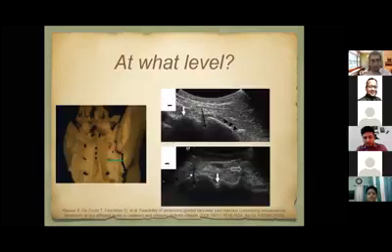So here I am trying to show the sacral foramina in this image. You can do it at the S1 foramina or at the S2 foramina. This is the first image at the S1 foramina. So this is the S1 foramen. When you move from the midline to the lateral side, first of all, you will appreciate the sacral foramen, and then you will come to the sacroiliac joint. So the next shadow is of the sacroiliac joint.